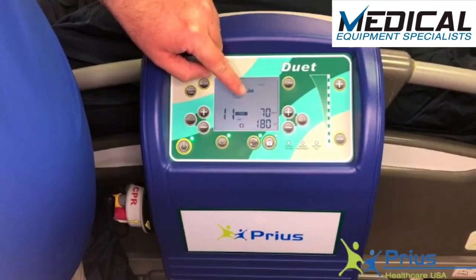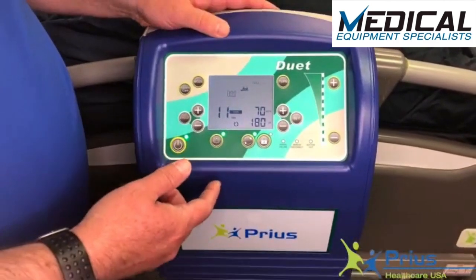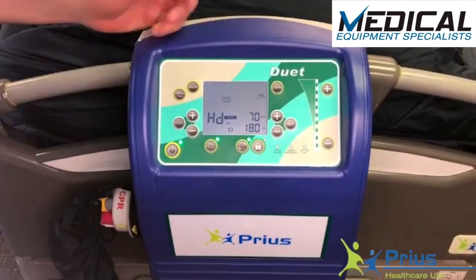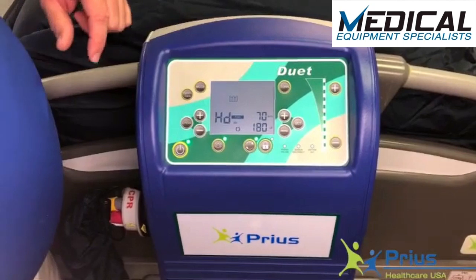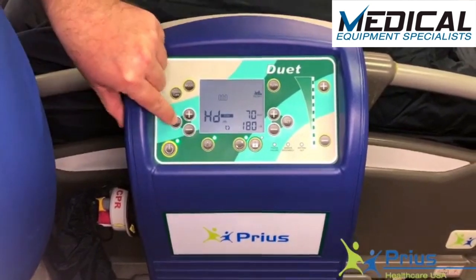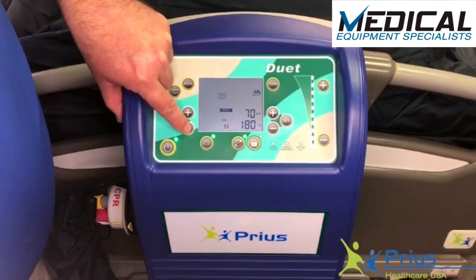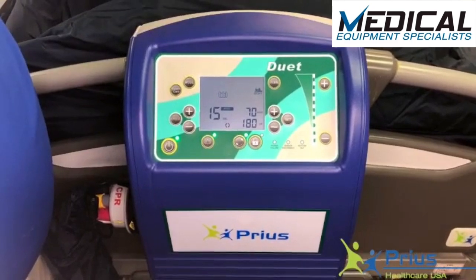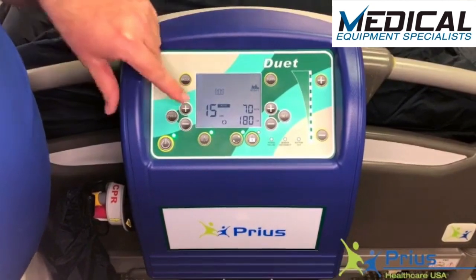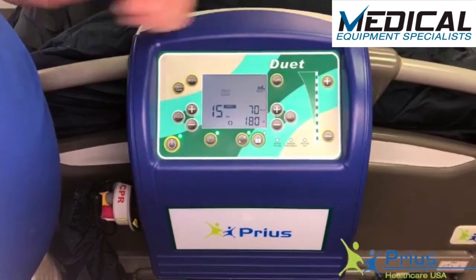When it's in full mode, the indicator lights show which phase of the turn the mattress is currently in. For a right turn, hit the turn button again; the right will illuminate and once solid, it defaults again to the hold position — just turning to the right and holding. If you set the cycle time, in this case 15 minutes, it'll go into the right position for 15 minutes, then to the rest position for 15, and repeat. The amount of time and whether a physician wants left, right, or full should be written with a physician's order.